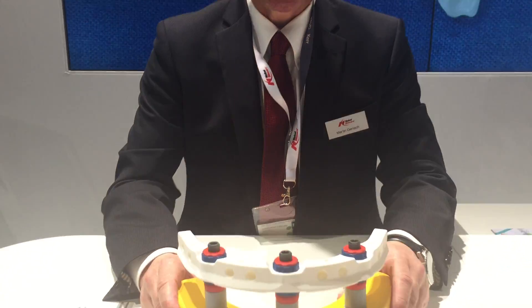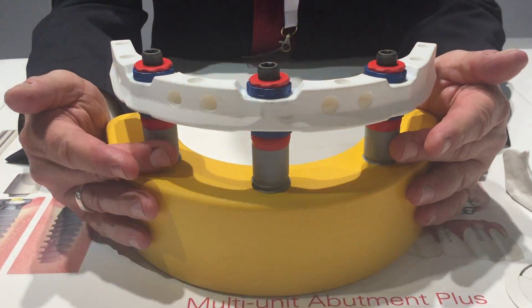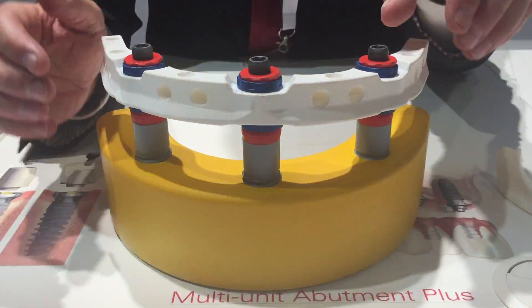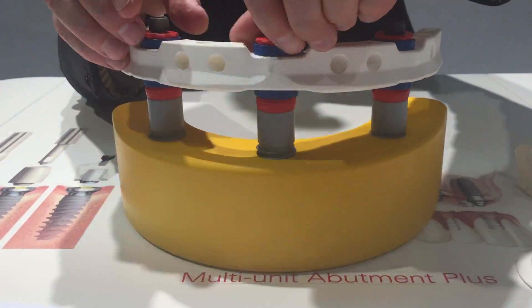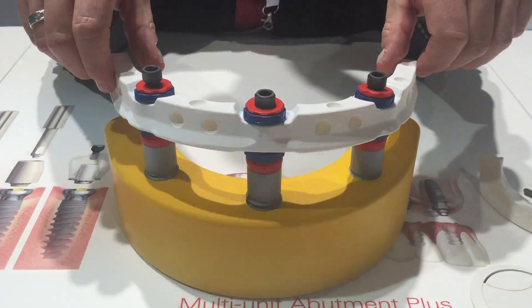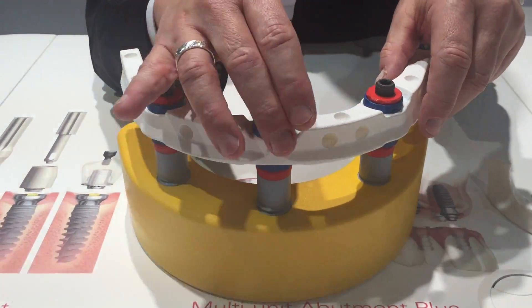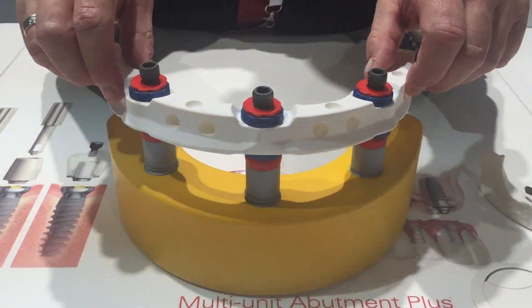When it comes to the uniqueness of the system, it is this Trefal bar. Because during implant placement there is sometimes some inaccuracy in implant position in a three-dimensional way, which can happen in the vertical, horizontal, or axial direction. And this standardized bar allows to compensate any inaccuracy during implant placement.